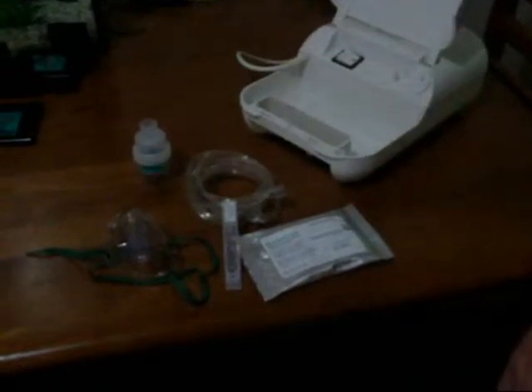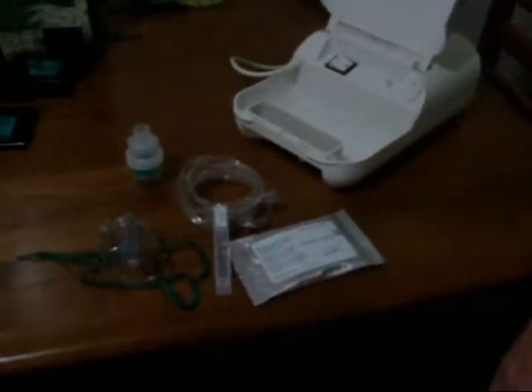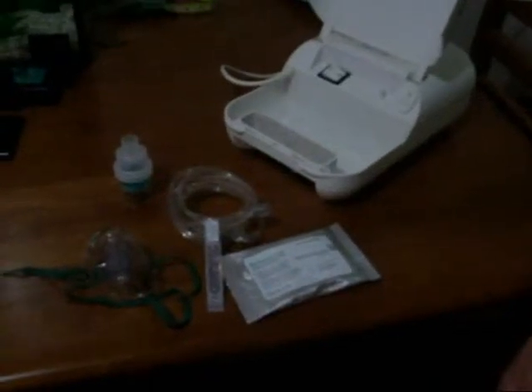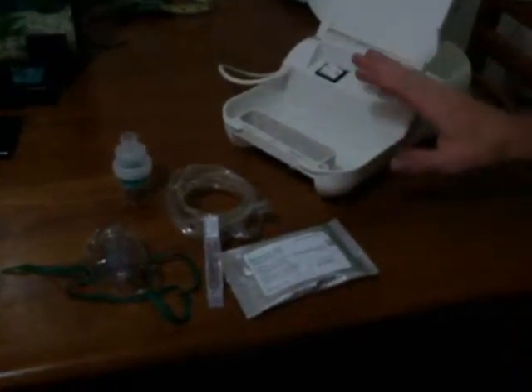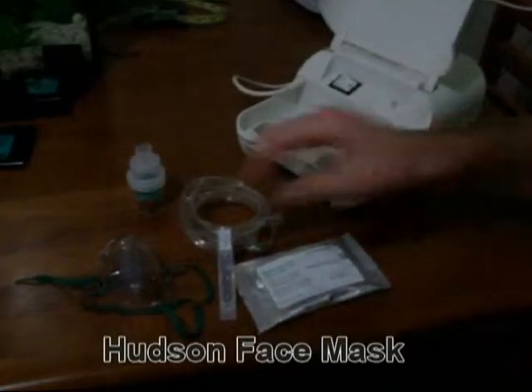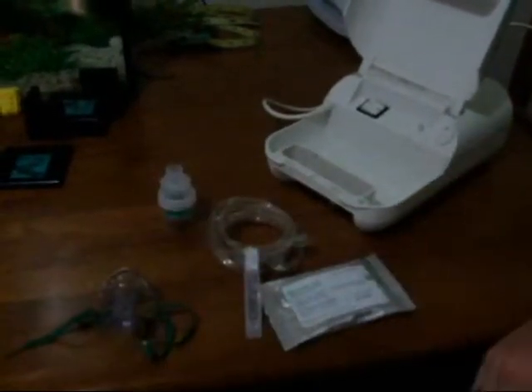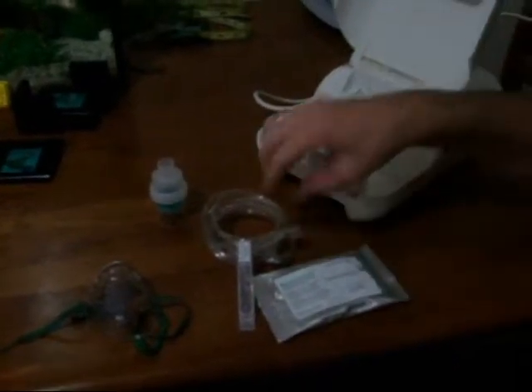Treatment of asthma can be administered in many different ways. One of those ways is using the nebuliser. In this method, ensure you have the correct shape mask for the person in question. In this case, we're using a child.